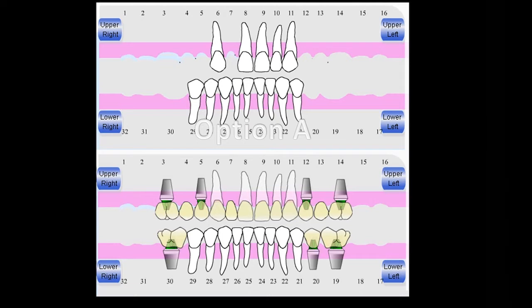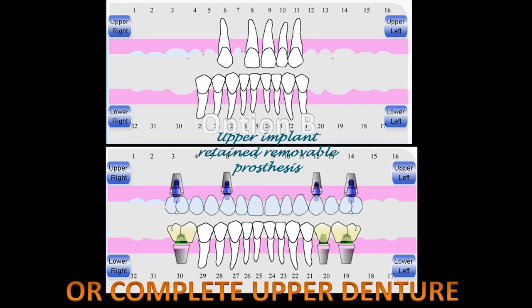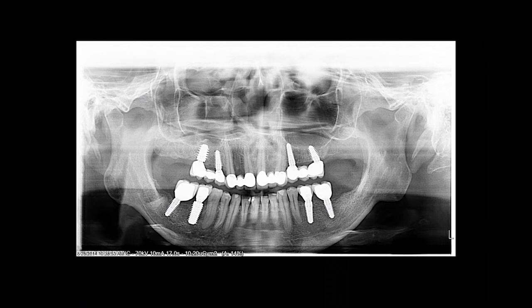Here's how it would be restored. 1 here, 2 down there, and then all the way across the top. And then you have option B. Option B is going to be to take everything out on the top, put 4 implants in, and make some palateless overdenture thing. And he really wanted to keep his teeth. So this is what we wound up with.